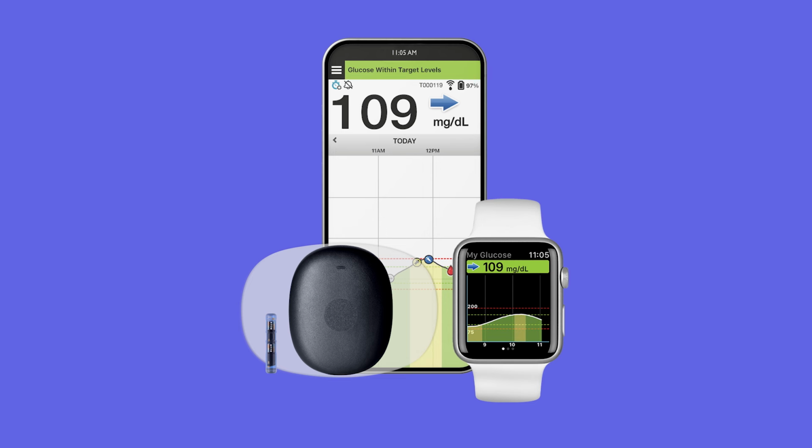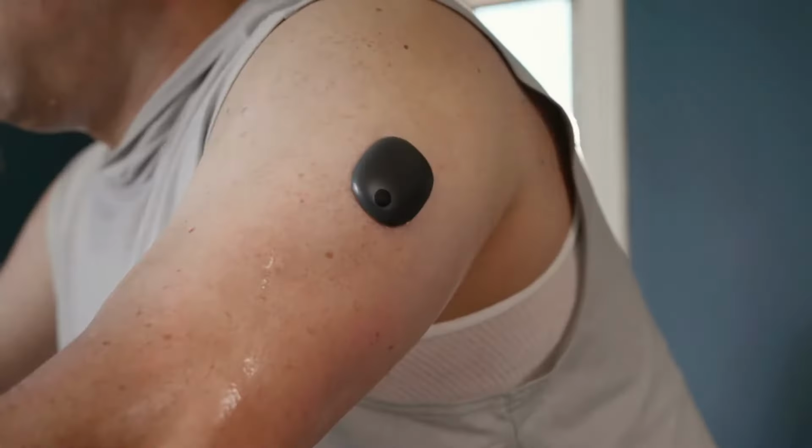Does it currently require internet access to intercept these readings, or is it possible for people to intercept locally, say if they're on a plane, and use that data? It's all Bluetooth, right? Bluetooth to the phone. Now, you need to have the Wi-Fi or cellular to sync with the cloud, but in real time, all of the calculations are done inside the transmitter today.